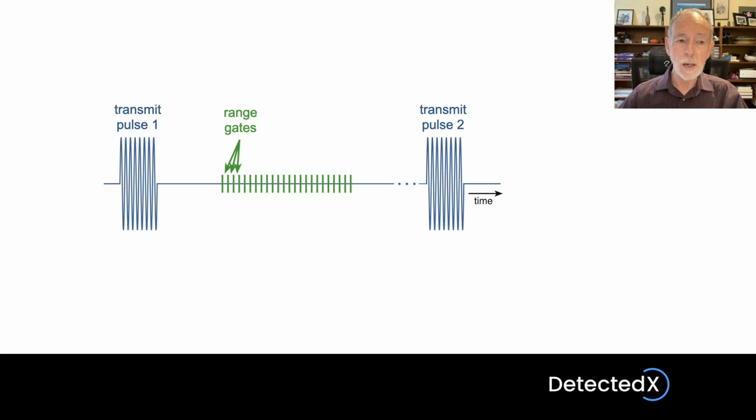So here's a timeline showing you what the transducer would see in an idealized sort of way. We have the transmit pulse, and then we have a series of range gates which are producing sample volumes spanning from the top of the color box down to the bottom of the color box. So the machine will be acquiring echo data from each of those range gates and processing each of them separately to produce Doppler estimates for each of the depths.